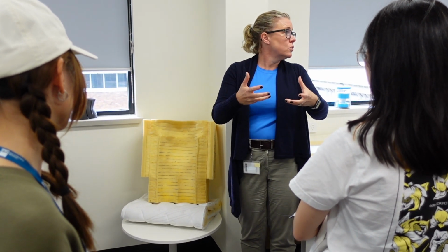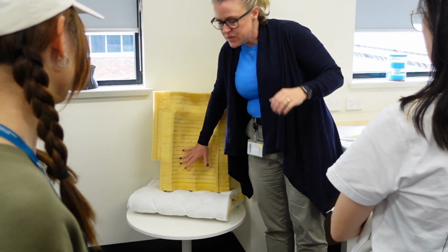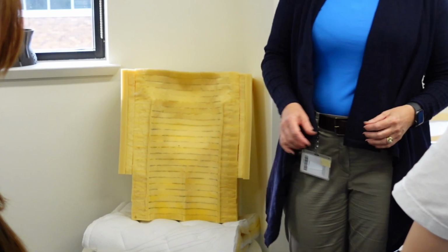After 17 successful spinal surgeries on patients from 2 to 15 years old, and even 2 adult patients in fact, we've successfully refined our workflow. While the initial design of the mattresses is a bespoke process, we see that it could be applied by orthopaedic or rehabilitative engineers to create customised support devices, not only for intraoperative care, but also post-operative support for patients of all ages with complex support needs.